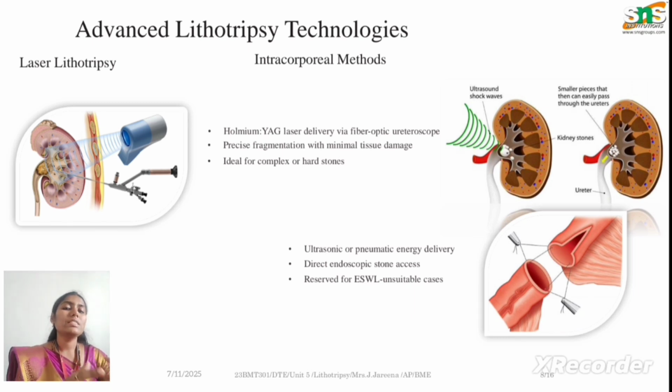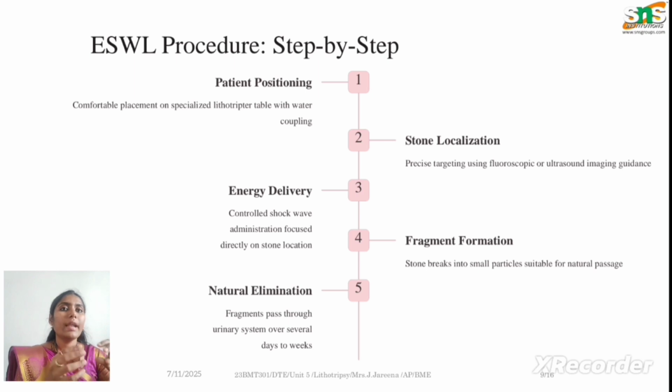So these are some of the advanced lithotripsy technologies. Next we will see what the actual procedure is that is carried out during the ESWL process. ESWL means extracorporeal shockwave lithotripsy.